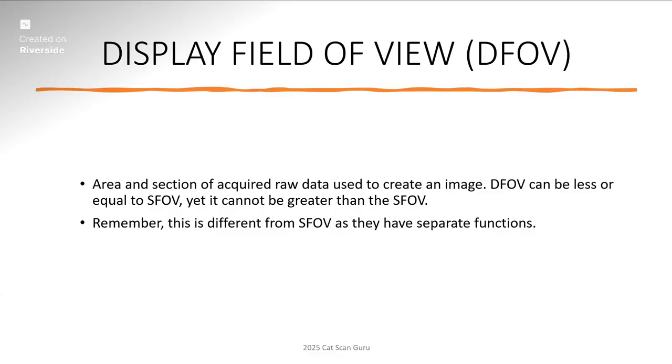Okay. So make sure that isocentering and patient positioning, and making sure you include everything in your scan field of view, is going to give you the correct display field of view. Now, what I want you to remember, because some texts do confuse this, is that your DFOV is different from your scan field of view. They have separate functions, so it's very important to know.